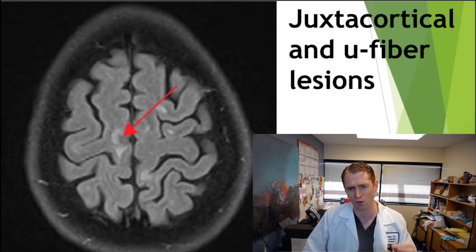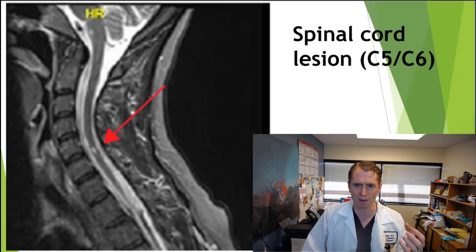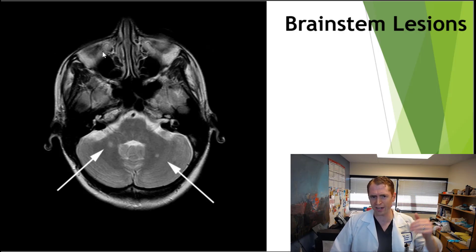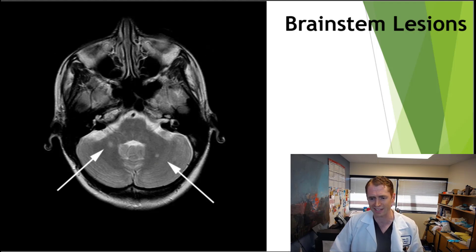Here's another image showing juxtacortical and U fiber lesions — essentially the same thing, but U fiber lesions have this distinctive shape. Here you can see another spine lesion typical of MS. You can also get brainstem lesions. Looking at an axial slice lower down in the brain, we're looking at the pons, middle cerebellar peduncles, and cerebellum. You can see a lesion in the right middle cerebellar peduncle and another in the left cerebellum, very typical of demyelinating disease.